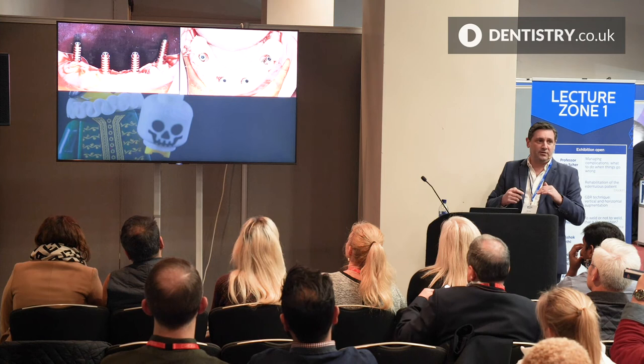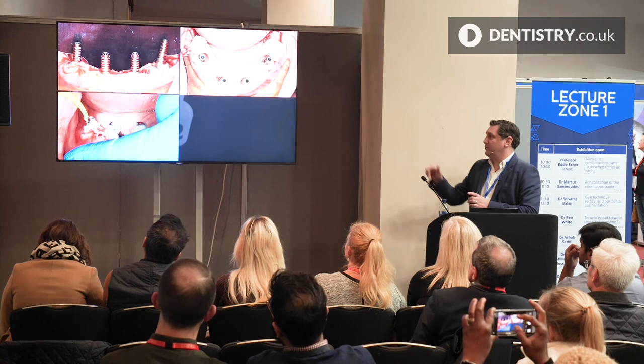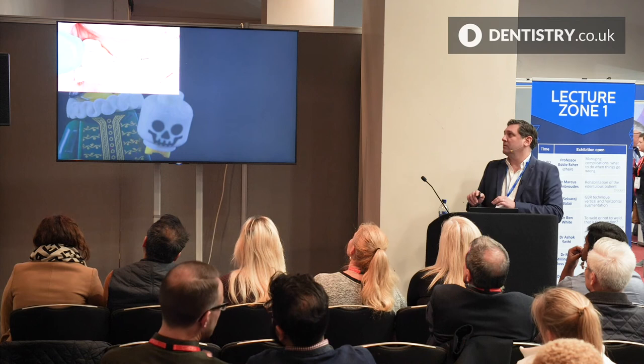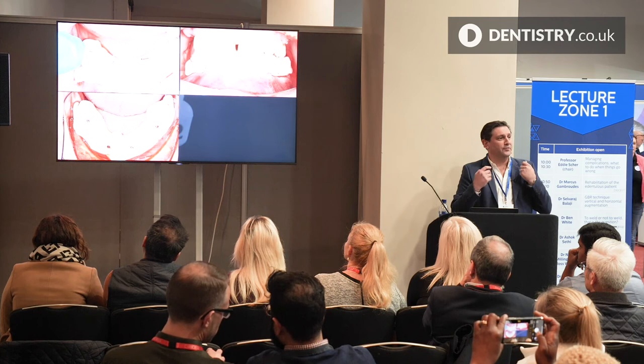We then take our Q resin, we syringe that around the temporary abutments, making sure we put some wax in the holes so we don't fill up the holes. Put it into our shell and then seat that in the patient's mouth. We seat it in place, patient bites together so we know it's in the correct position. We let it all set, that's then unscrewed, goes to the technician, and finishes it all.